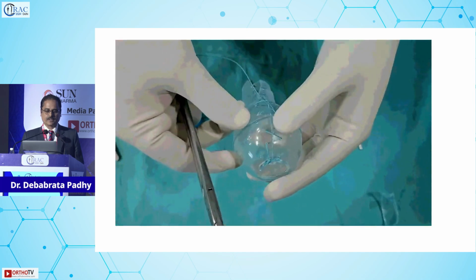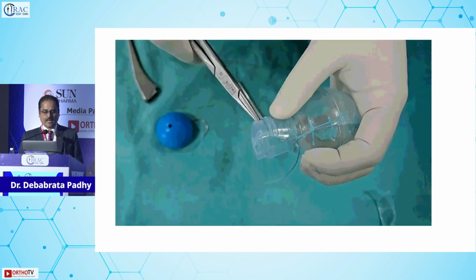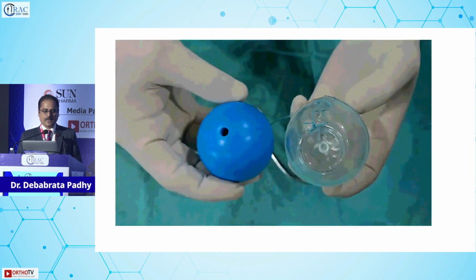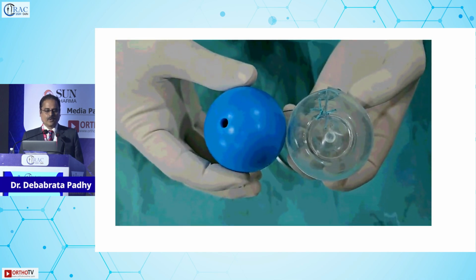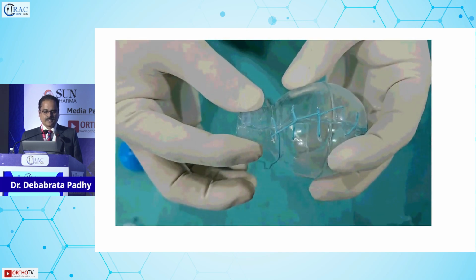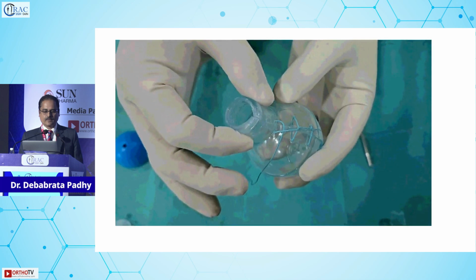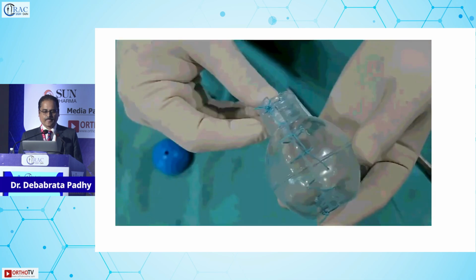Any suture is good enough, and that seals the whole of the head, and we open the distal part to make the opening for the passage of the cement. So this is how the whole head is prepared, and it is almost equal to the desired head size.